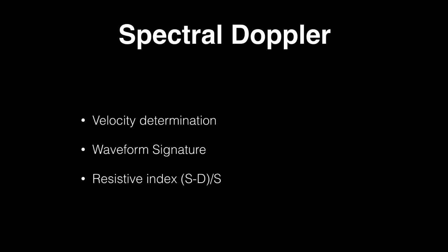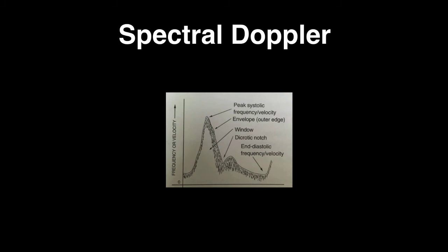The low resistance arterial waveform features a large quantity of forward flow continued through diastole. Now, high resistive indexes are seen in vessels supplying high resistance vascular beds that require intermittent or on-demand blood supply. Clinical examples of this would include facial, femoral, and superior mesenteric arteries. In these arteries, high peripheral resistance impedes diastolic flow at rest, whereas low peripheral resistance allows significant diastolic flow during increased activity.